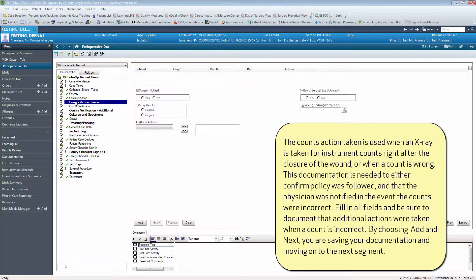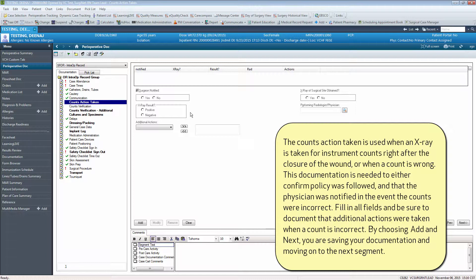The counts action taken is used when x-ray is taken for instrument counts right after the closure of the wound or when a count is wrong.